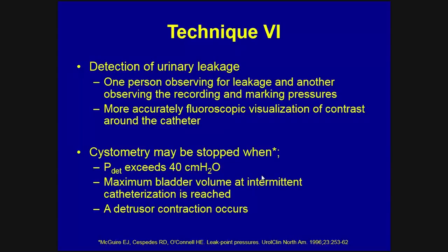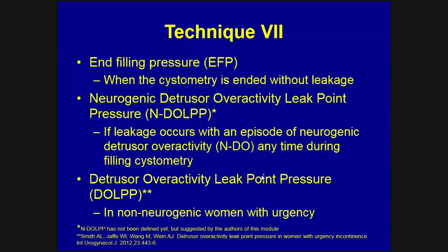Or a maximum bladder volume at intermittent catheterization is reached can be another stop point. Or some authors have stopped the cystometry during their studies when a strong neurogenic detrusor overactivity contraction has occurred. Not all cystometry in this patient group ends with leakage.